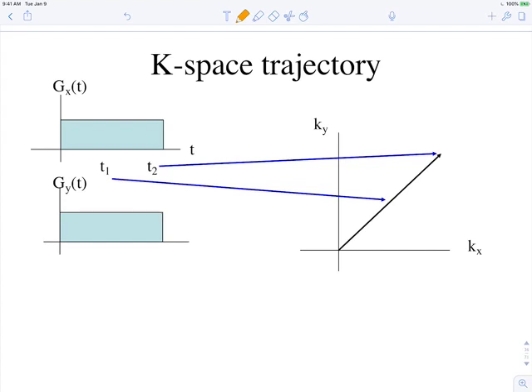Yeah, that's a great question. So the answer is yes and no. If you have a real object, if everything is ideal, then there's something called Hermitian symmetry, where the positive and negative frequencies exhibit a symmetry. But in reality, the object is not real because there are variations in the magnetic field due to things that you can't control, and so there are some phase terms which make it so that symmetry isn't preserved. So typically, you can do something called partial Fourier, where you acquire all the data on one side and just a little bit on the other side. There are tricks you can play, but you can't normally get away with just ignoring all of them. If someone's interested in an interesting project, that would be a good project to do.